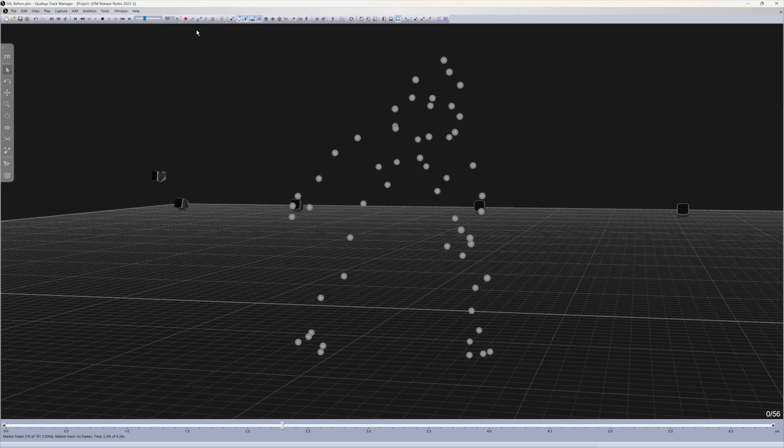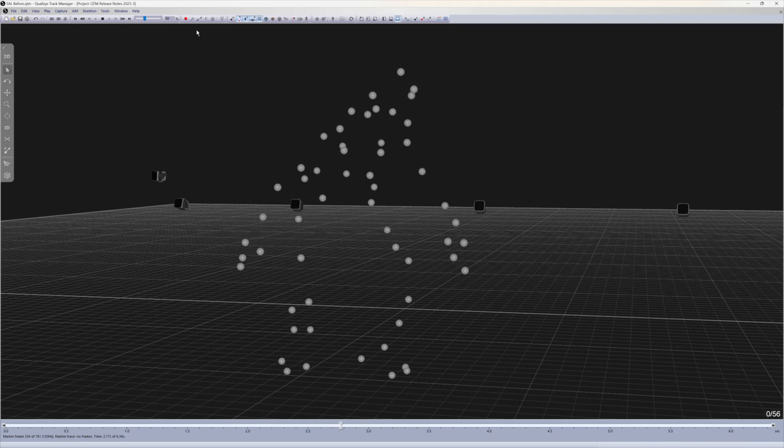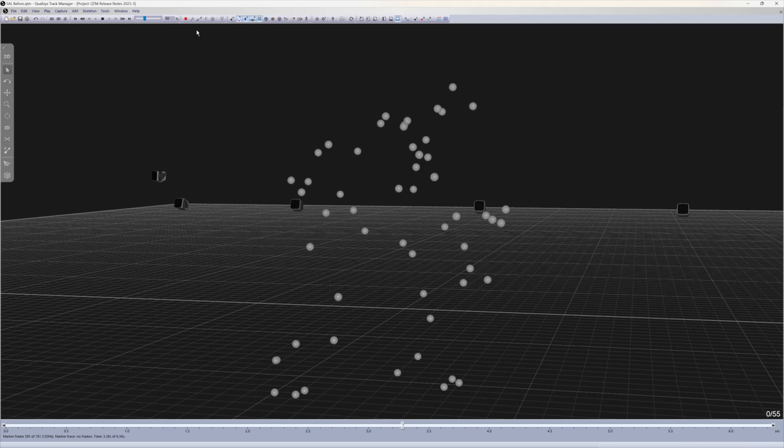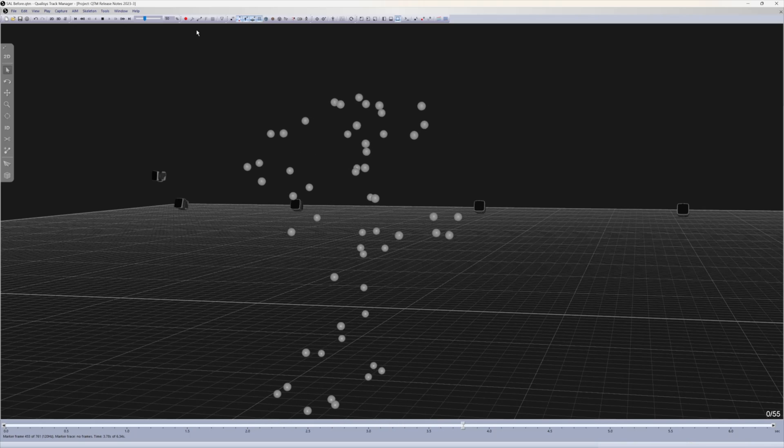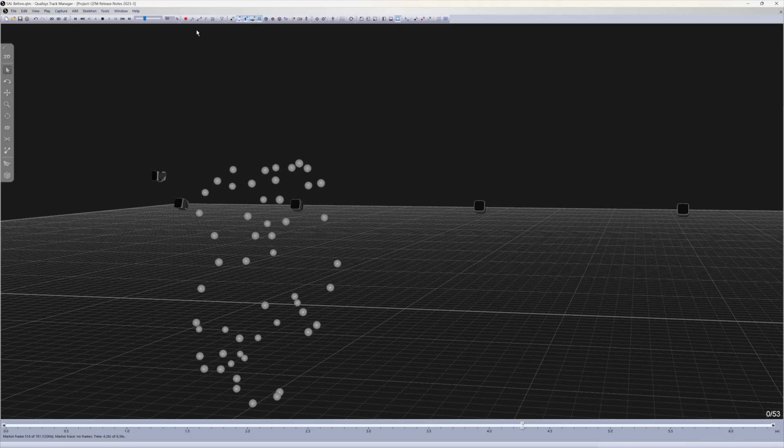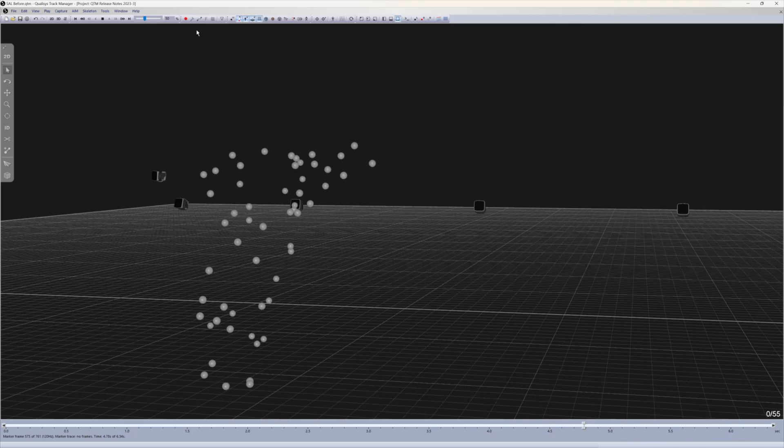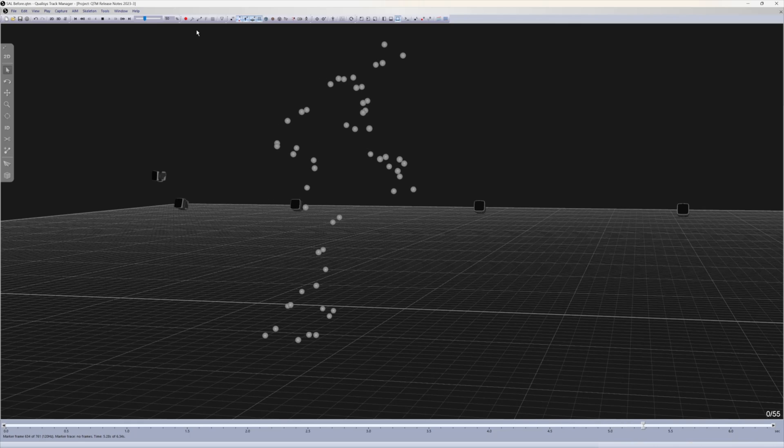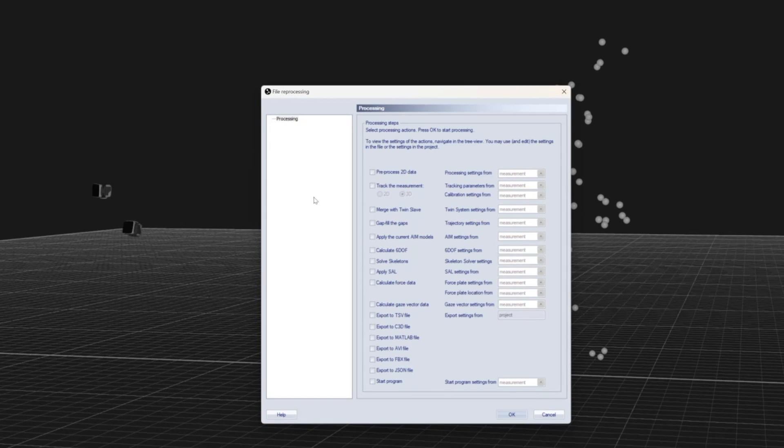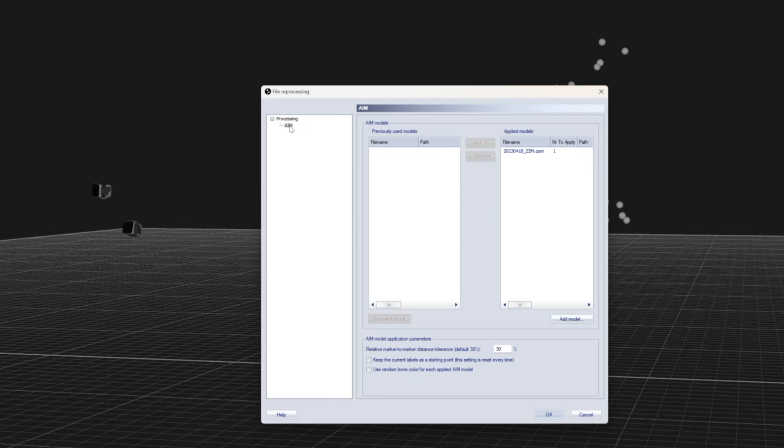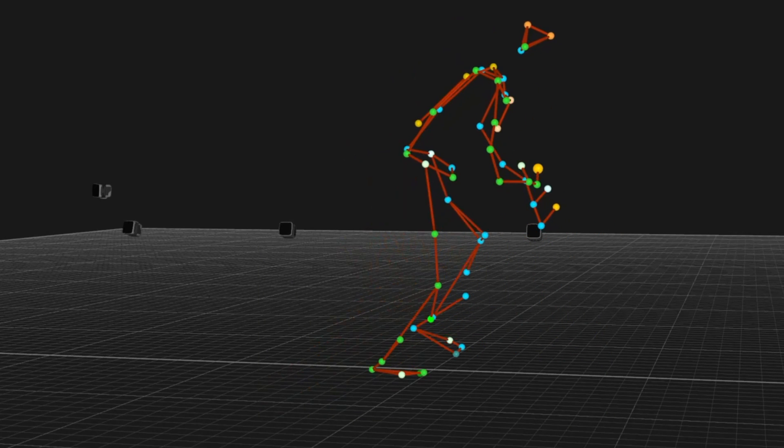The automatic identification of markers information is now saved with every measurement even if AIM is not enabled as a processing step. This allows you to apply AIM to previously recorded, unprocessed data.